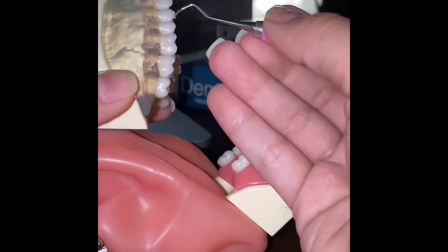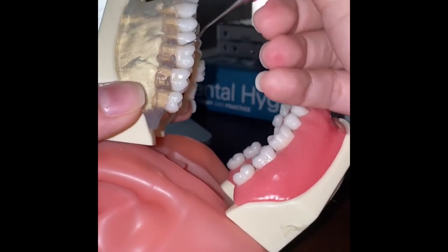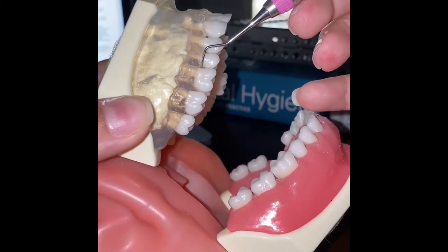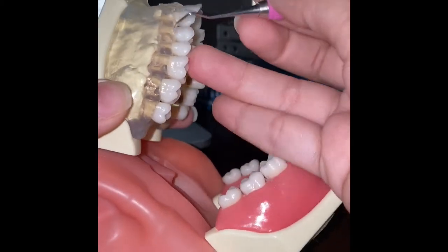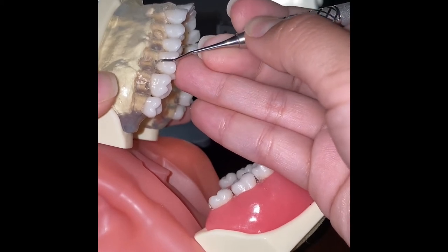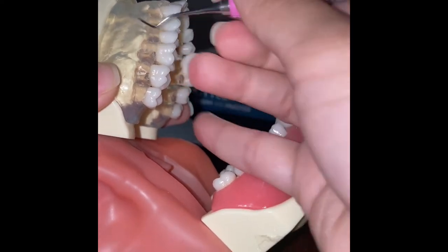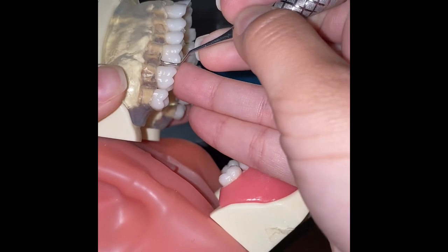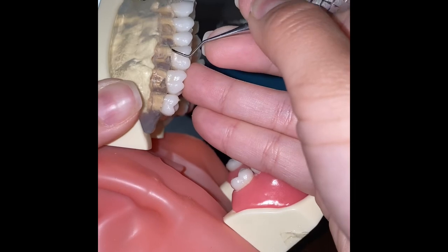First we have to find the correct working end. If we put it in with the terminal shank hugging the tooth, that's how we know it's the wrong working end. We begin at the distal line angle, work interproximally, remove the instrument, return to the distal line angle, and work mesially in short overlapping strokes.